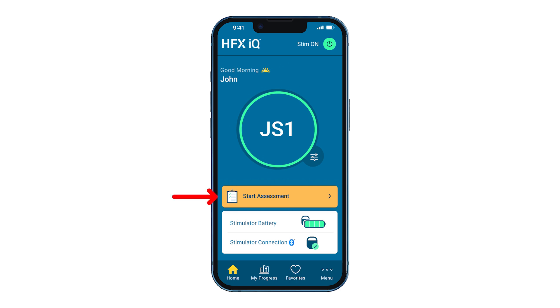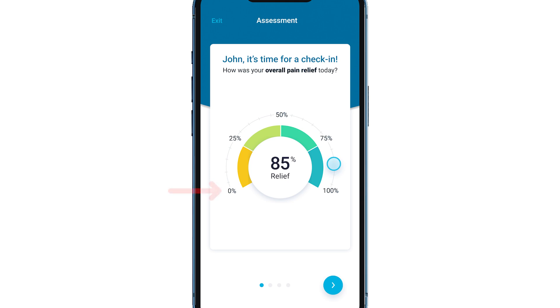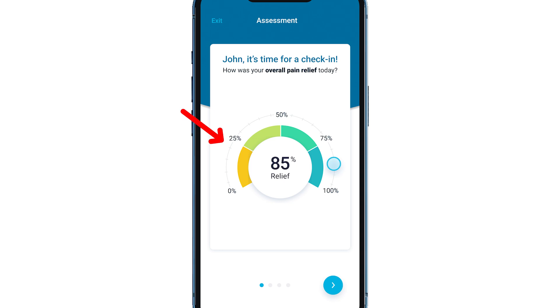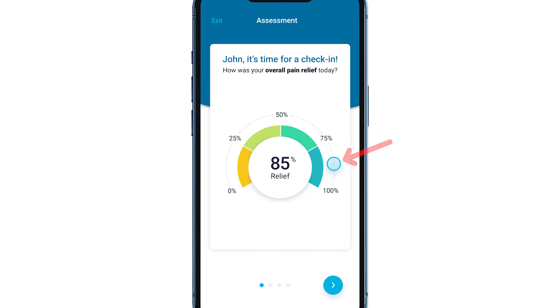On your home screen, you will tap Start Assessment, where you'll first provide an overall percent of pain relief. You will start with your finger on the 0% and slide your finger from left to right along the circle of percentages until you reach the overall percent of relief you have experienced with this current program.